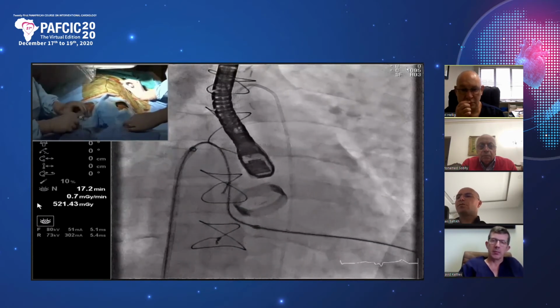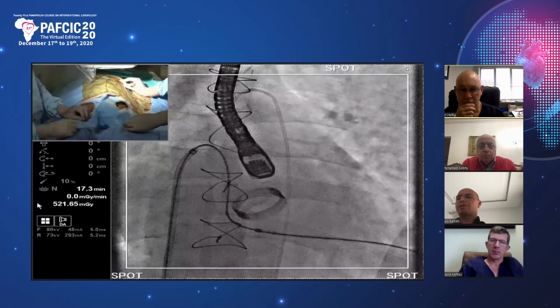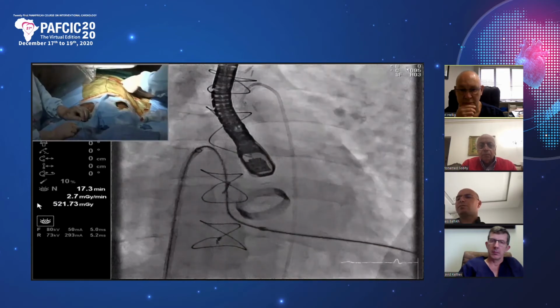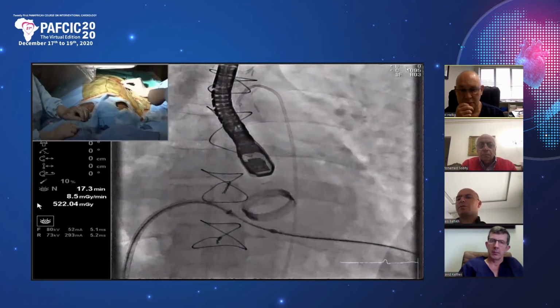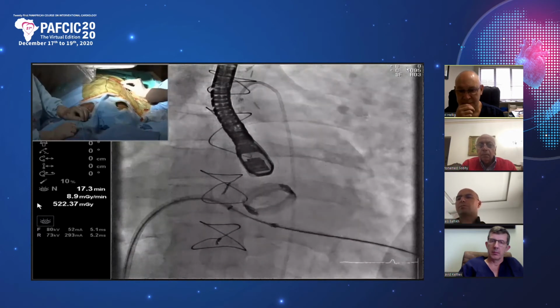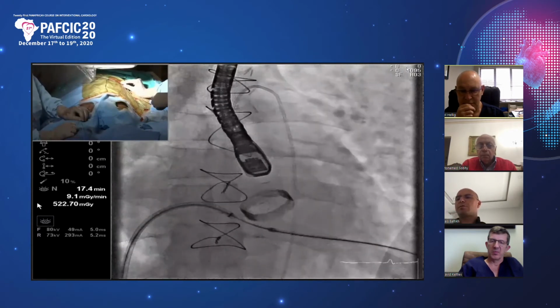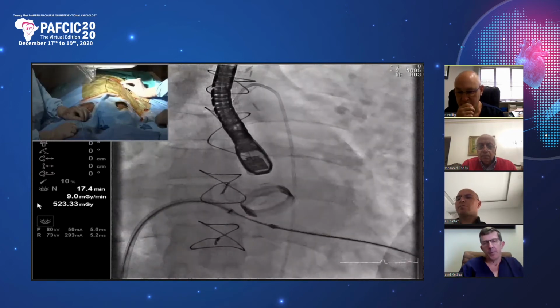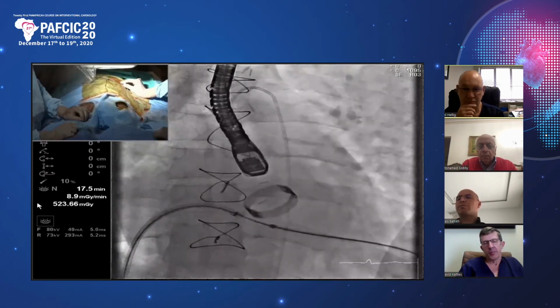Okay, so then I'm going to hold the wire and tell Shaheen to pull the catheter out. So I've got the wire, it can't come out. Just pull the catheter. Well, slowly, Shaheen. Slowly, slowly. So you see everything's straight. Yeah. So everything's looking much more coaxial now. Looks good. Come, pull it right out, just pull.